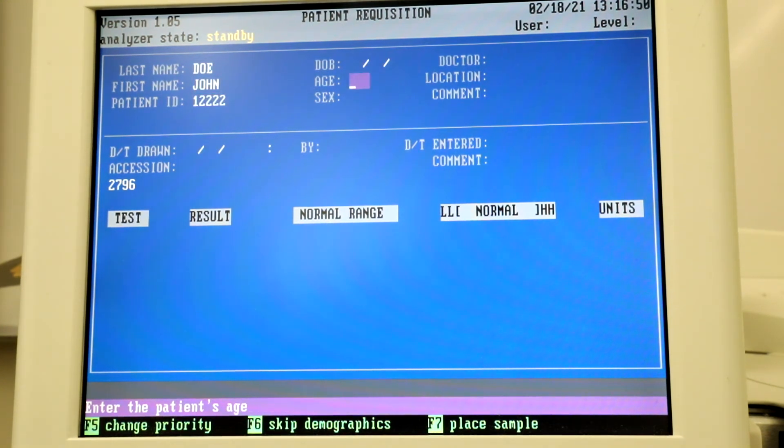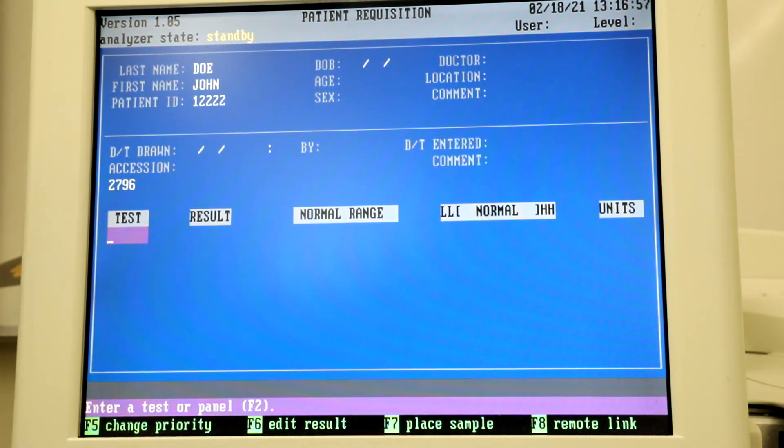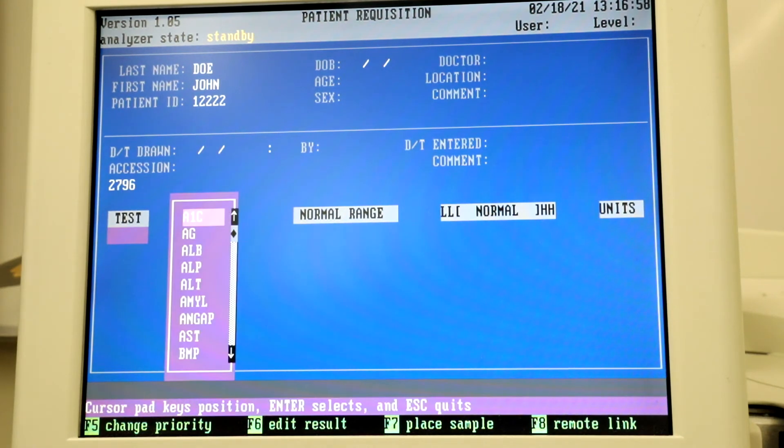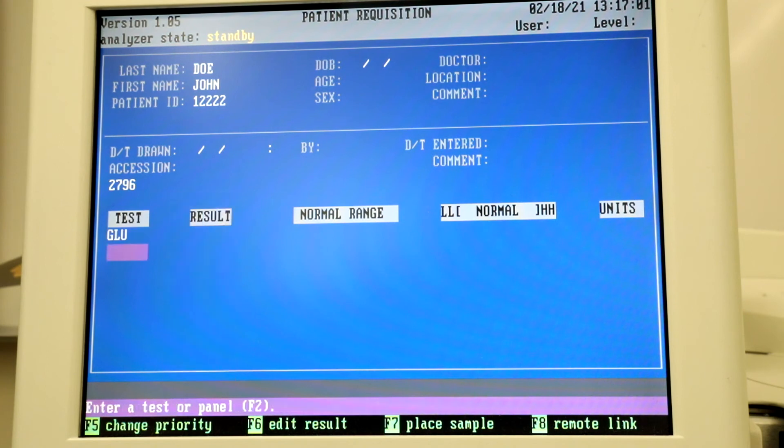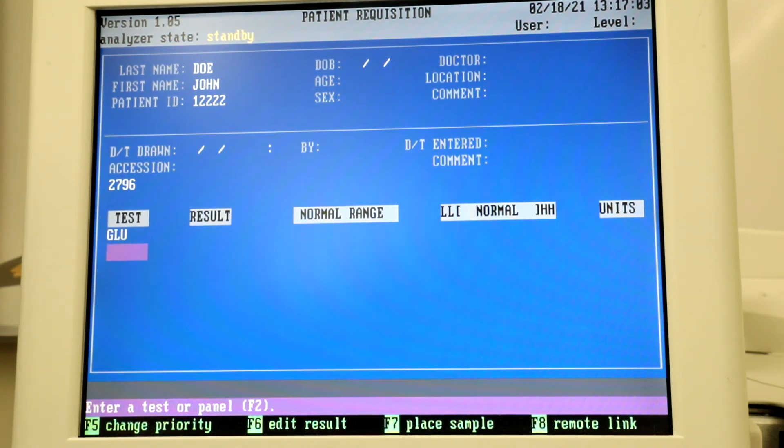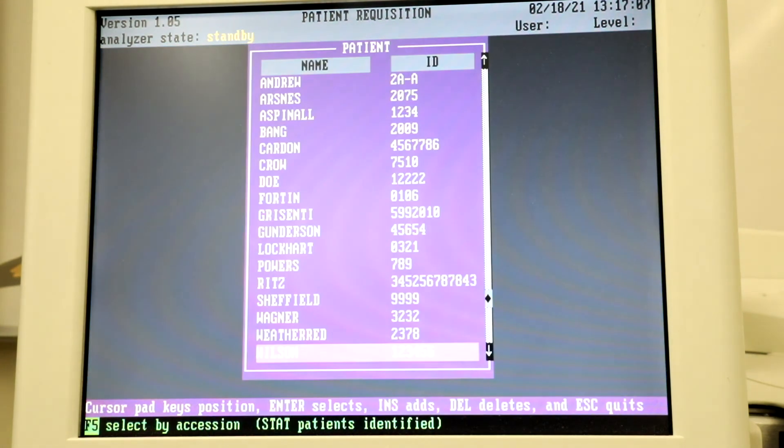Next tab all the way down until you reach the test section. Hit F12 to bring up a list of analytes. They will be abbreviated. Once you have added all desired tests, hit Accept, then Escape to the main menu.